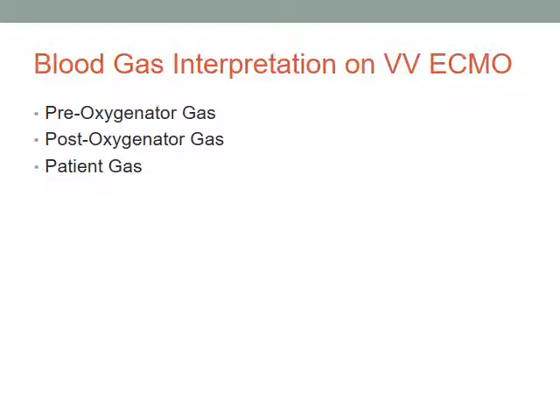So if we, let's go back to this panel. If we really turn this flow up really, really high, it's not hard to imagine that we're putting more into that right atrial space than can go through into the ventricle. So some of it's going to go up the SVC or down the IVC and get sucked out. So you see another patient at 4 liters and you decide to crank it up as high as it'll go, let's say to 6.5, you might find that that actually increases your recirculation more, and you may not get the benefit that you expected.